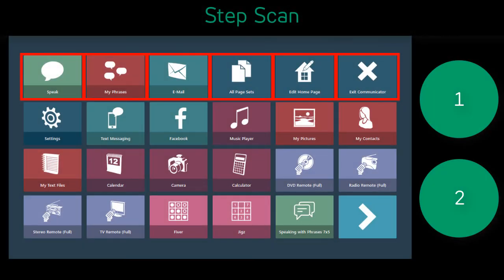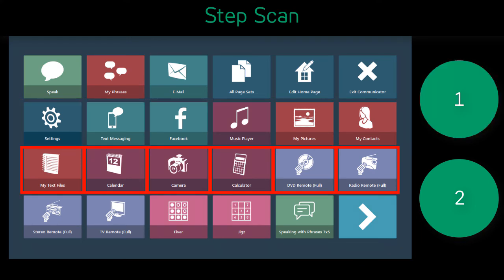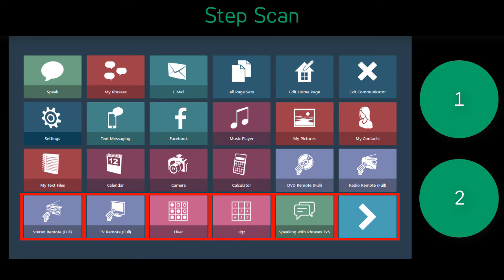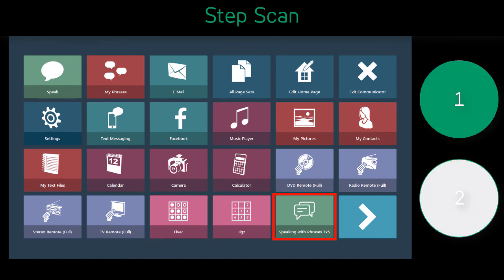As you watch the video, notice the scan indicator, or the red outline, and the two switches on the right side of the screen. Notice how the scan indicator does not follow a regular speed and transition. Also notice how the individual will activate switch 1 to move the scan through the options on the screen, and then will use switch 2 to make a selection.